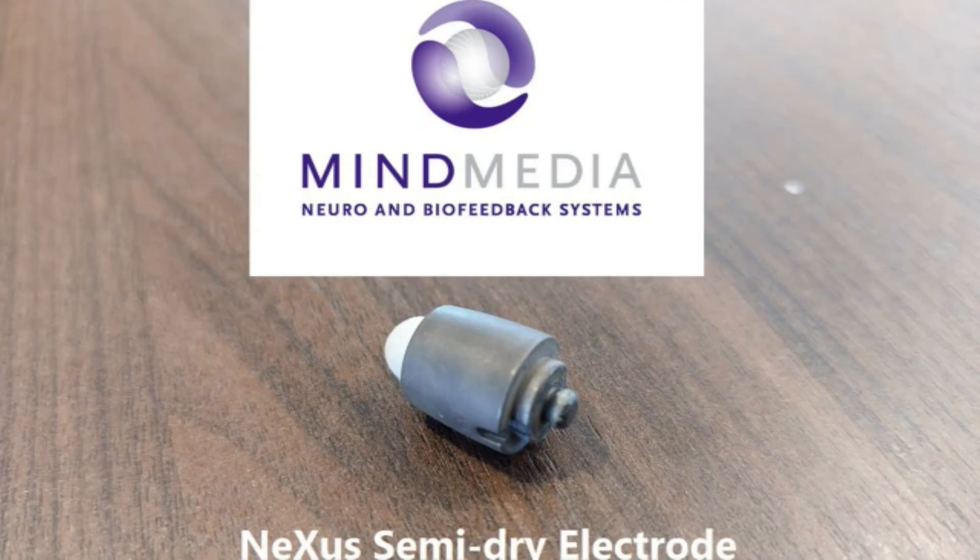We're still using a kind of gel — like ECI gel — but just a small drop. That means if you've used this cap, you're not going to have big blobs of 10-20 gel in your hair. The next step is this semi-dry electrode that I showed you.